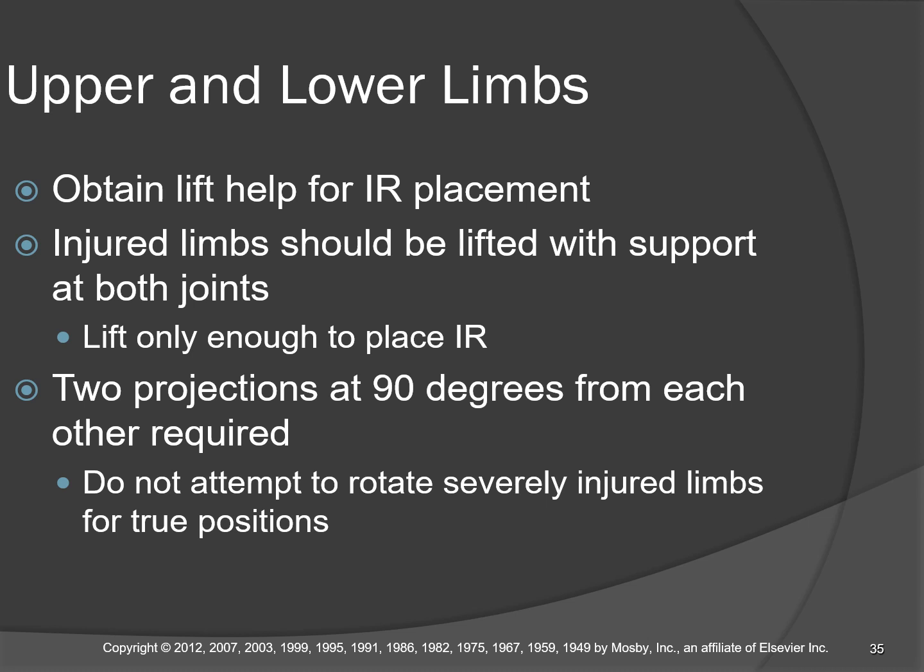Two projections at 90 degrees from each other are required. Do not attempt to rotate severely injured limbs for true positions. Okay? You can use tube angle in the transverse plane to make an oblique body part look true AP, but don't rotate the patient's body part. Okay?